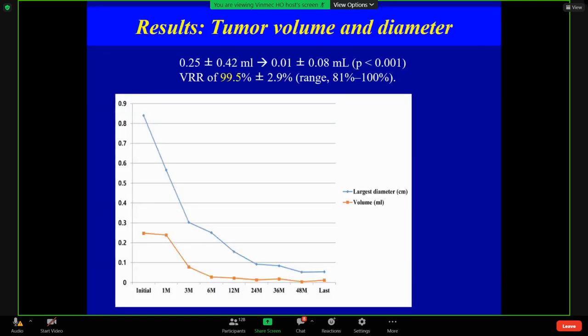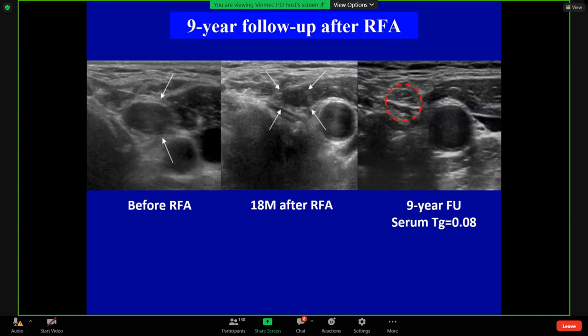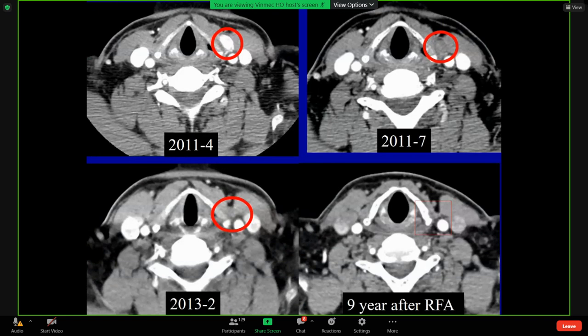Tumor volume and diameter decreased like this. Here is a 1.5 cm lymph node metastatic recurrent tumor managed by RF ablation — decreased and completely disappeared. At 9-year follow-up, the serum thyroglobulin level is normalized. CT scan shows the intensely enhancing tumor now shows no enhancement.